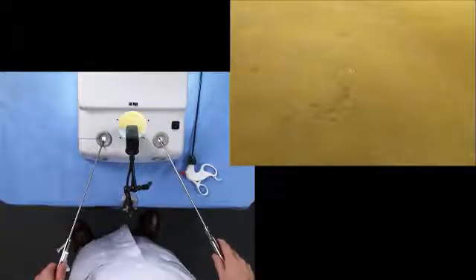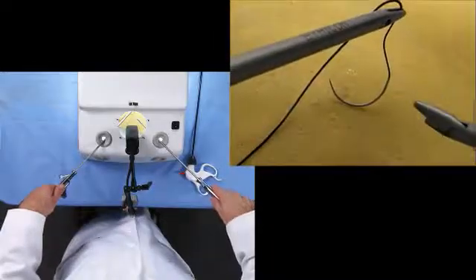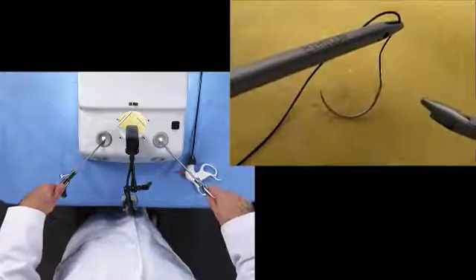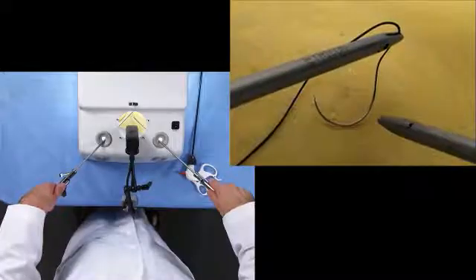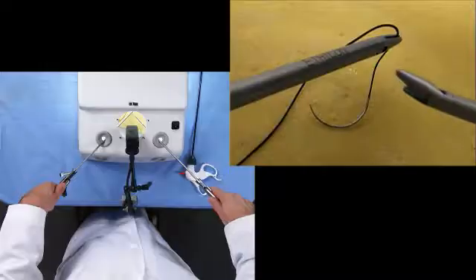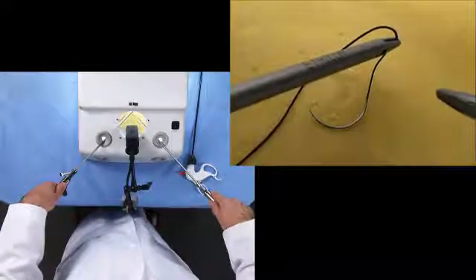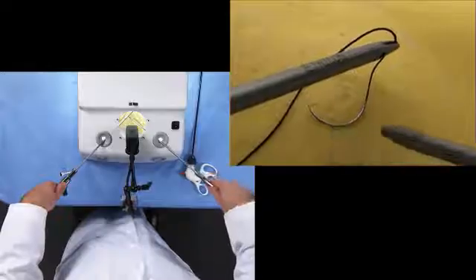Now we're going to tie an intracorporeal interrupted suture using the roster technique. We introduce the needle with the non-dominant hand with the tip of the needle pointing to the left, and we grasp the suture at the grasping point outside of the training box with the needle in this correct orientation.